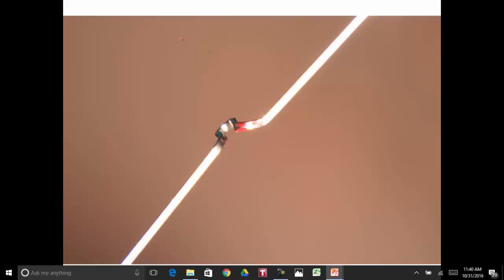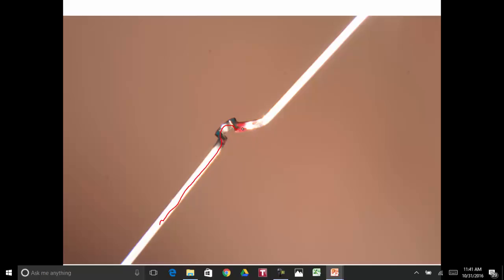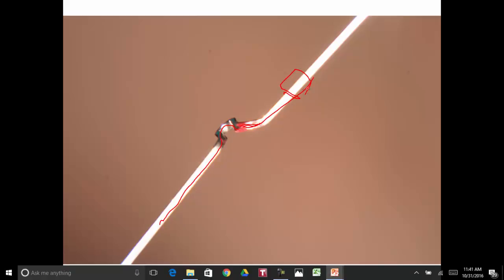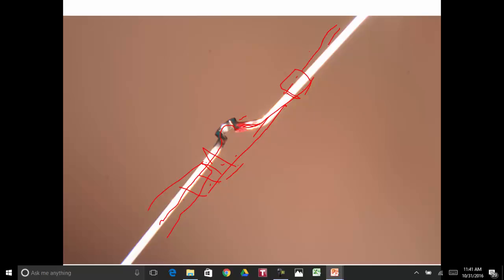Now it's bent in. The omega is totally to the outside. Makes a bend, comes across here, and then this will be where your bicuspid bracket will be fitting in there. This will go into the molar tube. Usually the molar is thicker, and so it needs a little bit of molar offset, and that'll allow you to slide this omega right past the bicuspid brackets and go in place.